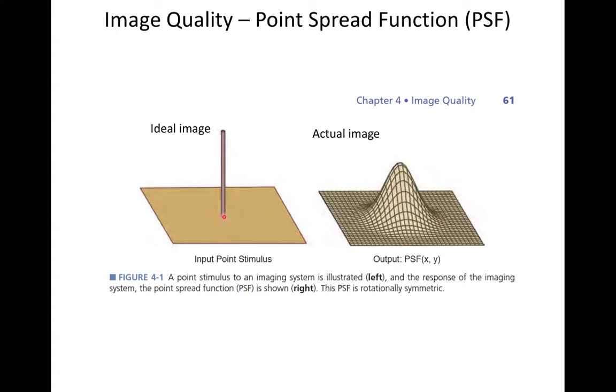And for echocardiography or for ultrasound, oftentimes they have a gel with tiny little beads in it, and you can measure the size of the beads as a function of position in the gel. So those are ways of directly measuring the point spread function.